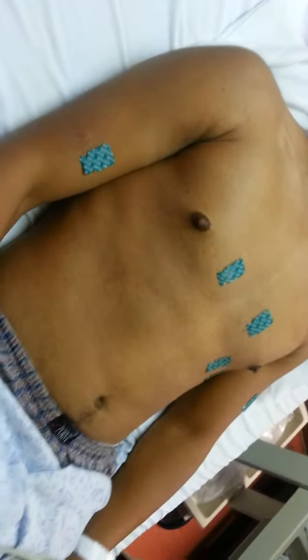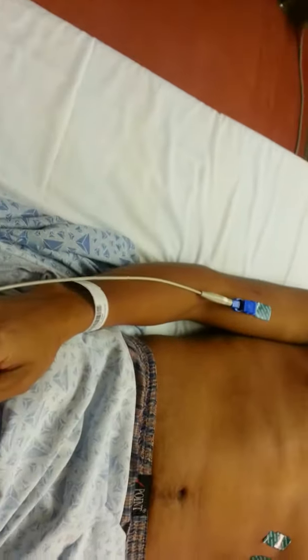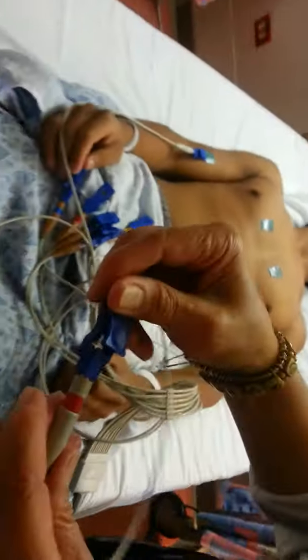The right leg goes here, then right arm — like this — right arm here. Left arm goes here, and this is the left leg.